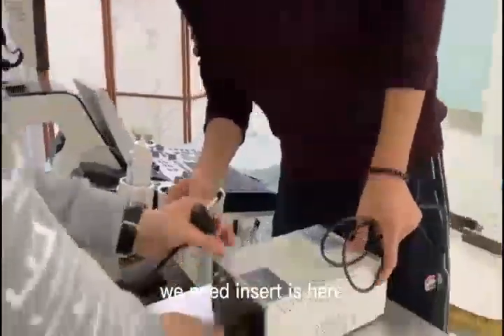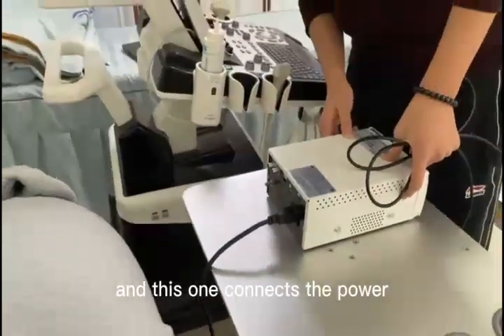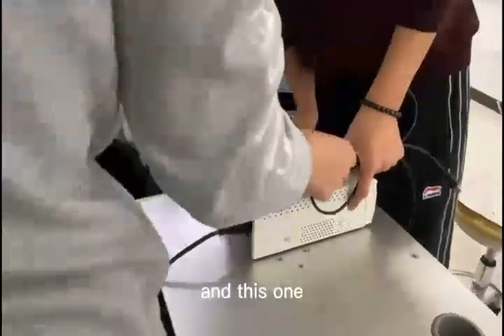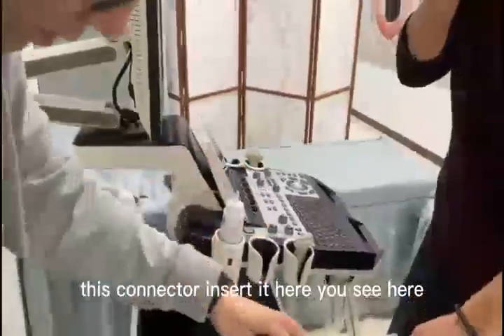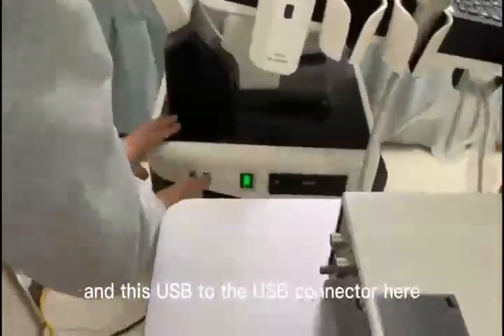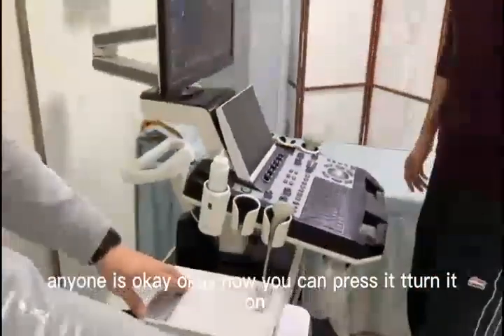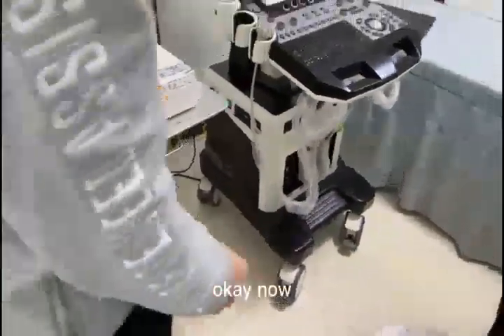Now, you see here? We need to insert it here. Yes. And this one connects to the power. Now this one — we use this connector, insert it here. You see here? I can see. And this is USB, so the USB connector. Anyone is okay. Now you can press it — turn it on. And it's on.